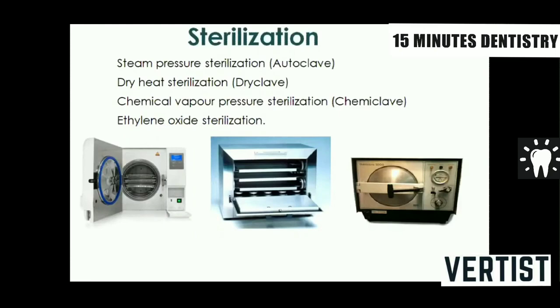Every time we have to follow the sterilization protocol. But now, during the COVID session and the post-COVID era, as I call it, we have to be very careful about each and every instrument, may it be a critical instrument, a semi-critical instrument, your dental chair, or any other thing.